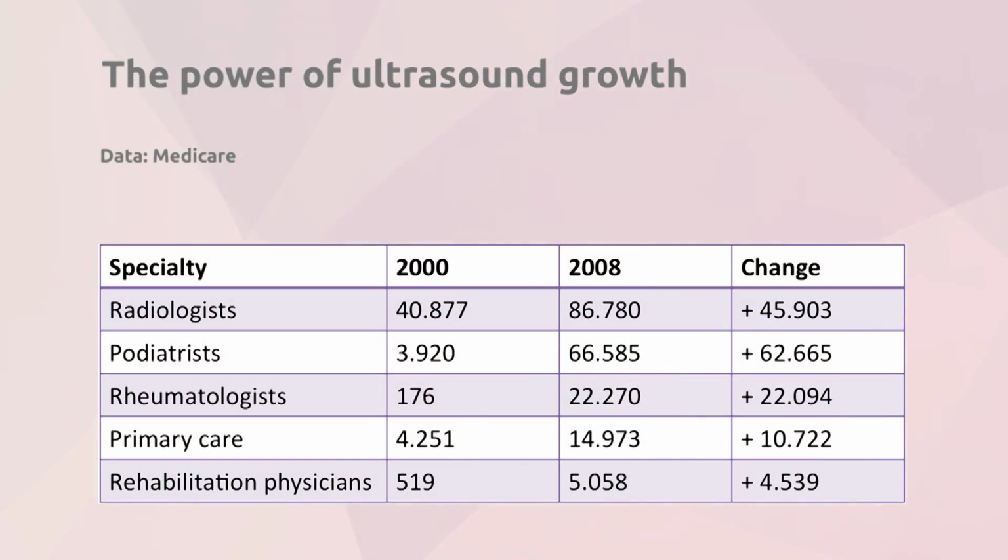Because of its advantages, its patient friendliness, its technological improvements, and its decreasing price, ultrasound made an impressive growth in several healthcare professions. Here you can see Medicare data about the growth of ultrasound in the US.